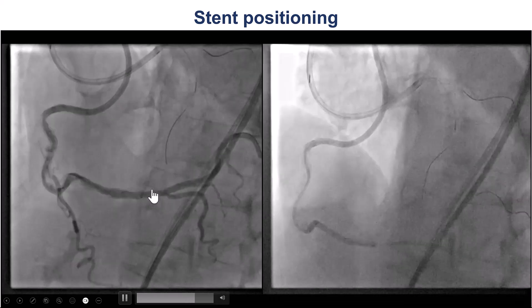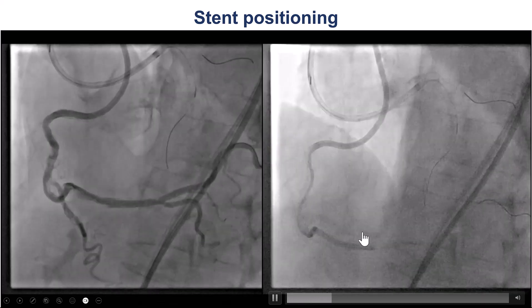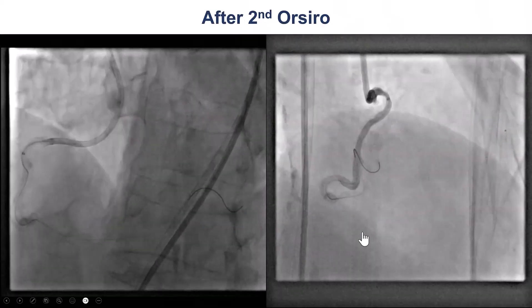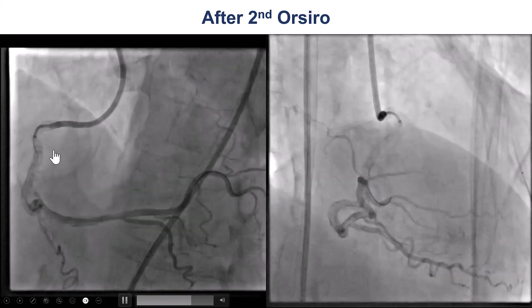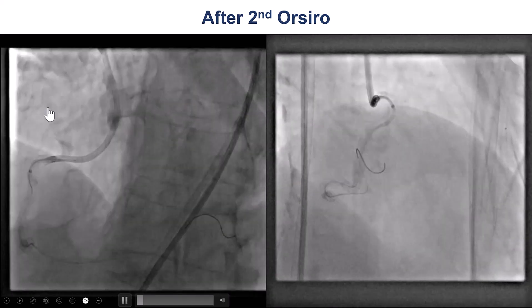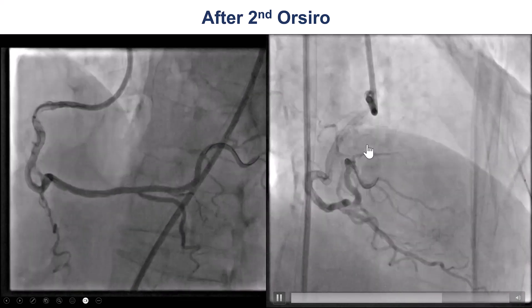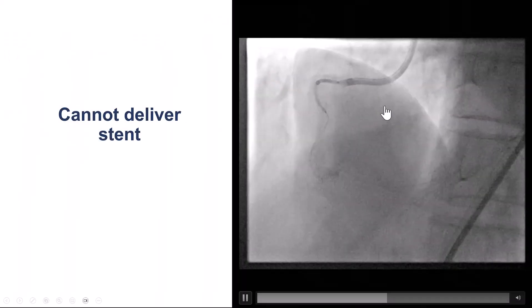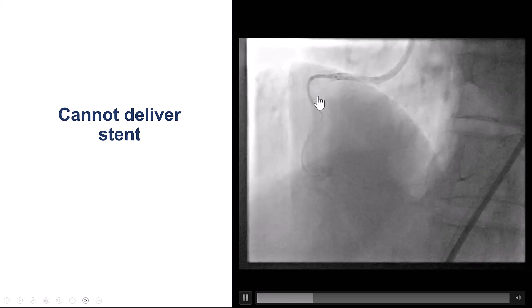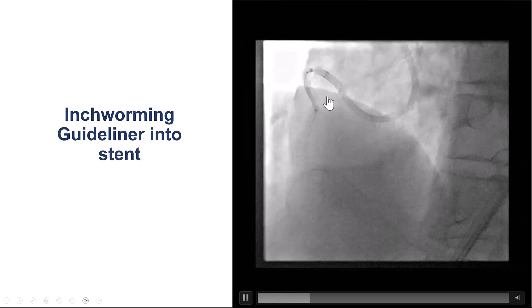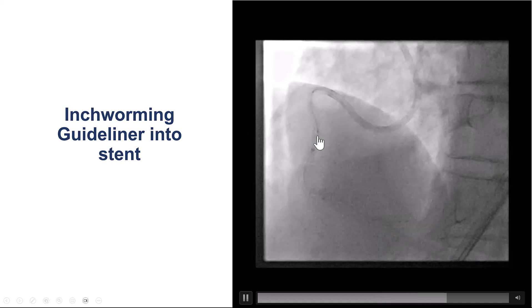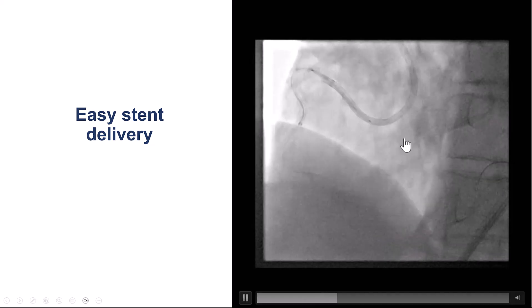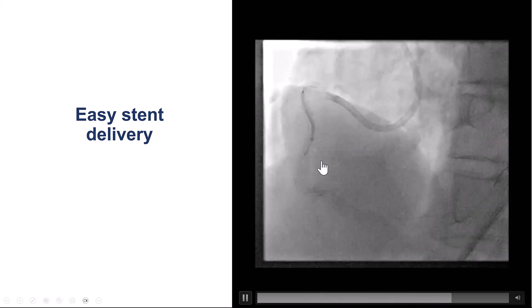We visualized the position of the stent, deployed it, and then placed another overlapping 3×40 mm stent more proximally. This provided a nice result, but there was still residual disease in the proximal RCA, and we were concerned that the Amplatz and the guide extension might have caused injury proximally. Therefore, we wanted to cover it with a stent. There were similar issues with stent delivery through the tortuous segment, so we performed inch-worming again with the Guide Liner inside the previously placed stent, after which delivery of the additional stent was fairly straightforward.